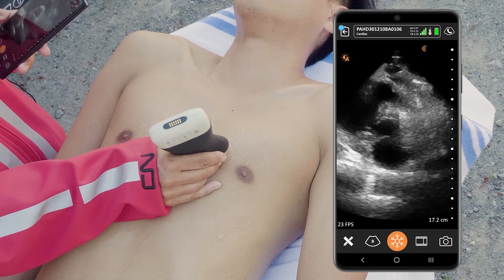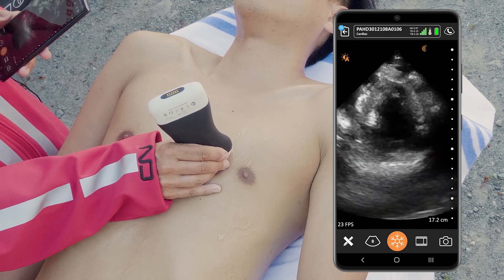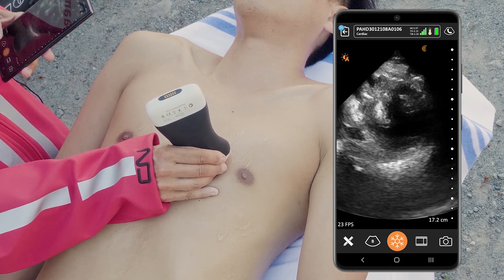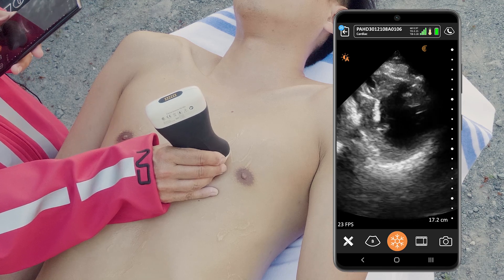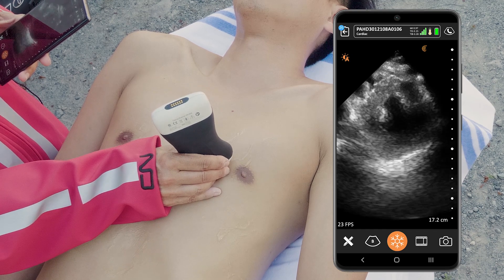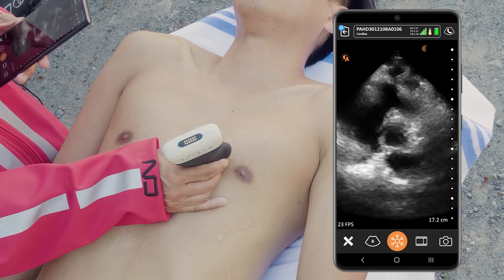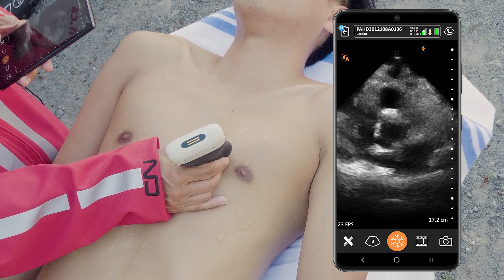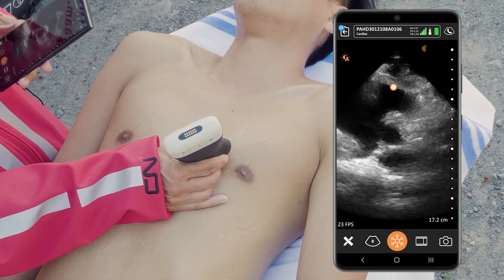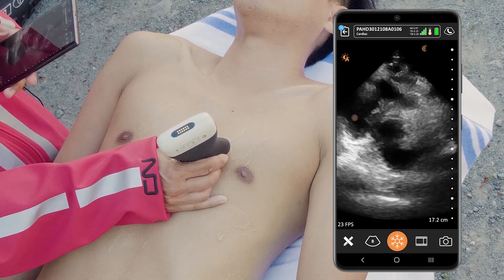I can rotate the scanner 90 degrees in order to assess the left ventricle in short axis, which gives me a really good idea of all of the left ventricular walls and how they're functioning, concentrically contracting. We can slide all the way down to the apex and then back to the mitral valve for a really good idea of left ventricular function. From this view I can also see the right ventricle at the top of the image and the left atrium below, so we can do a rough assessment of ventricular and atrial size.